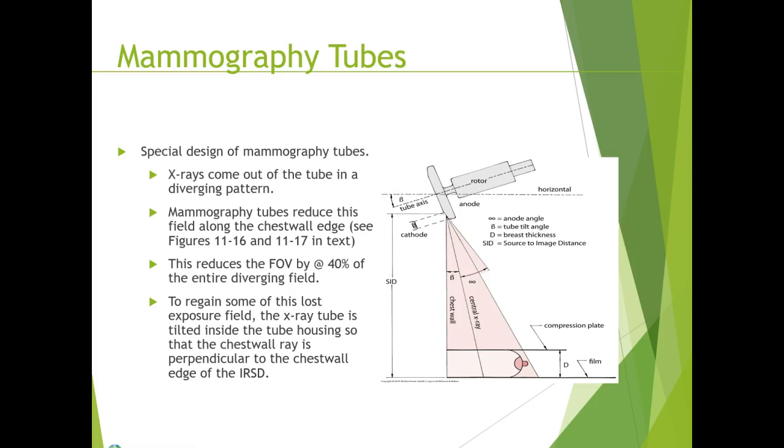So let's talk about the special conditions of a mammography tube. The mammography tube is specifically designed for breast imaging in a mammography X-ray unit.